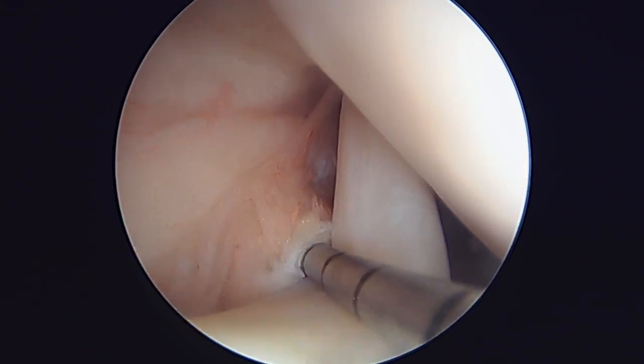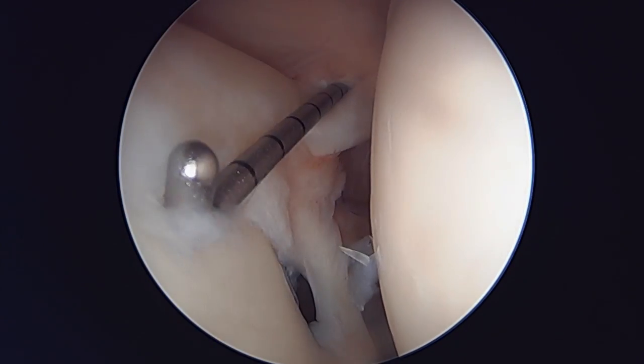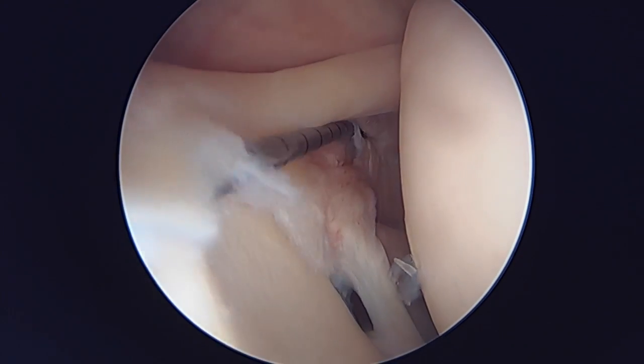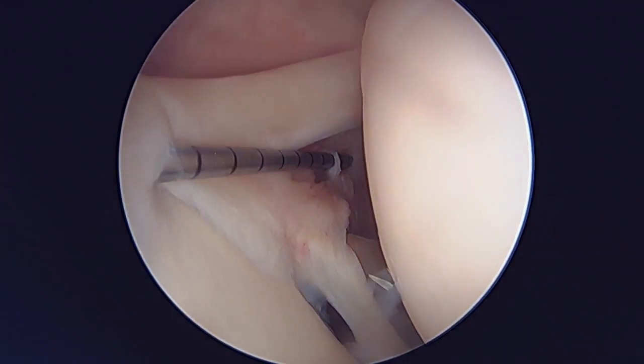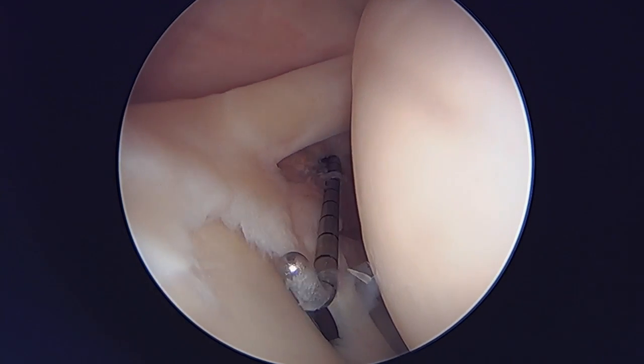If we follow that around, you can see the long head of the biceps coming in and attaching to this area of the labrum up top. That's a really bad tear in this patient. It's debated in the literature a little bit, but given this patient's age, we're going to do a biceps tenodesis.